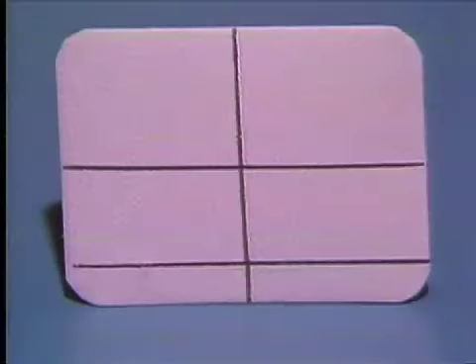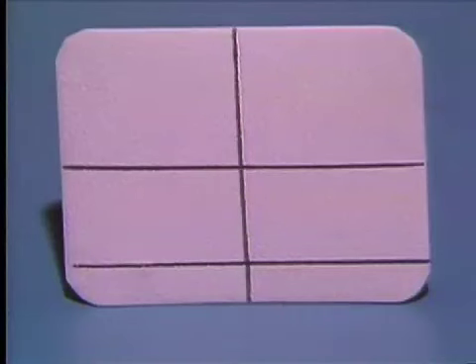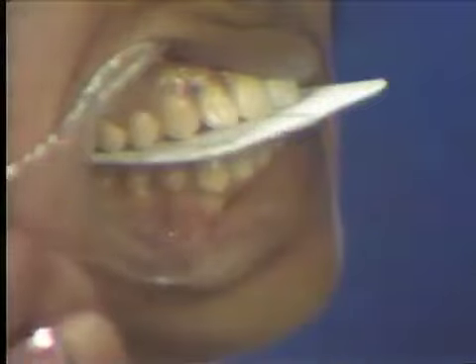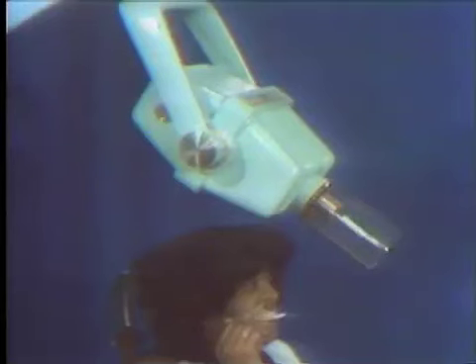To aid in beam alignment, centerline marks can be made on the film before it is placed in the patient's mouth. Another line, one quarter inch away from one long edge of the film, facilitates film placement. For the maxillary posterior occlusal radiograph, the film is placed on the occlusal surfaces of the teeth with the sensitive side toward the maxilla. The buccal cusps of the teeth on the side of interest are placed on the one quarter inch line. The patient is positioned with the occlusal plane parallel to the floor, and the vertical angulation is set at 60 degrees downward, the same as for the maxillary anterior occlusal radiograph.